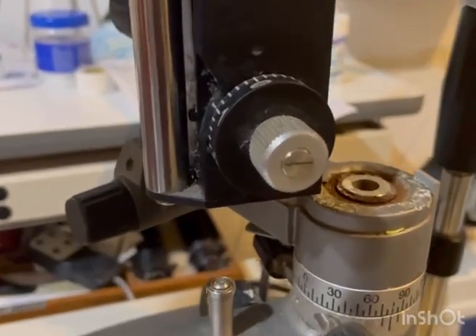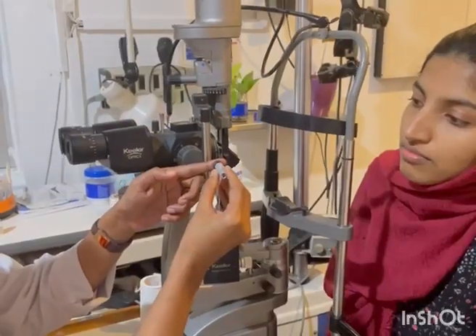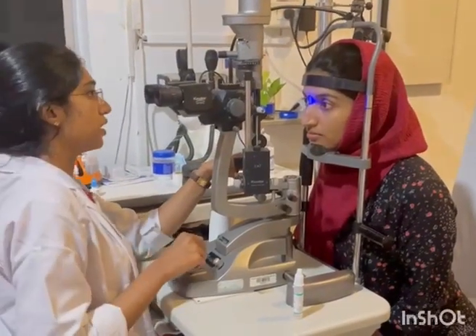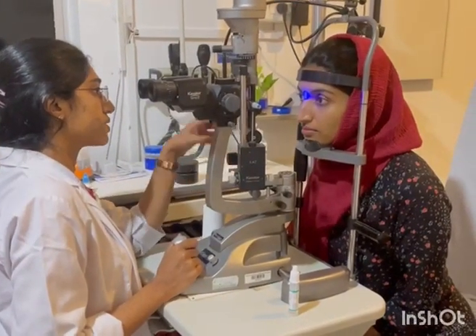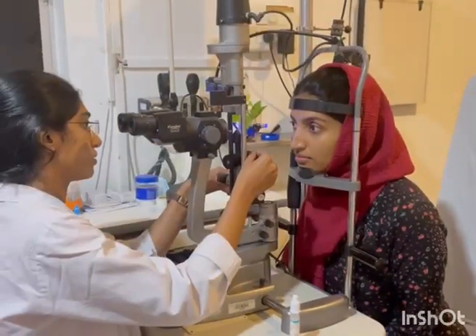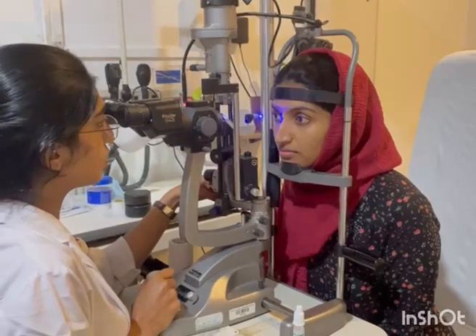Keep the AT drum at 10 millimeters of mercury. Make the patient seated comfortably on a slit lamp with chin resting on the chin rest and forehead touching the headband. Slit height and width should be maximum with full illumination and magnification of 10 times.